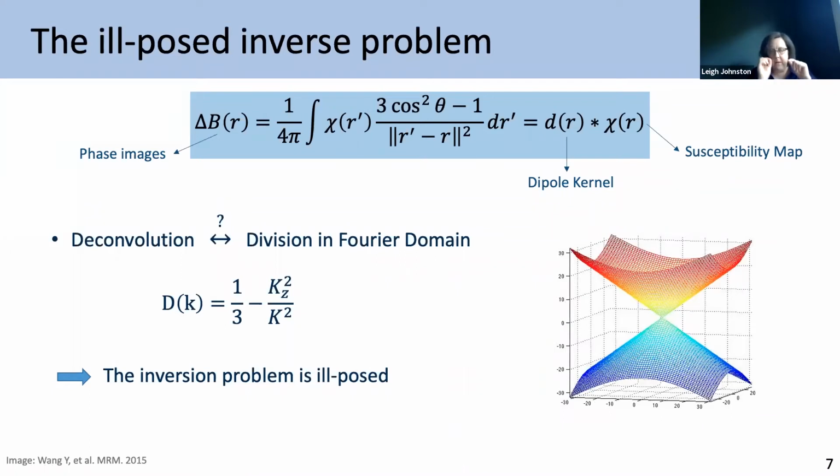However, there is a problem with this, and it's this equation on the left-hand side, if you're interested, where there's this three-dimensional K space, or Fourier spatial frequency space. When this value is equal to 0, then we have an unsolvable problem, essentially. So our inversion becomes ill-conditioned, and this causes problems and artifacts for us when we're trying to get at this chi value. And so all of these QSM methods that have been in the literature for so long, the reason that there isn't just one way to do this is because everybody's trying to work out how to remove the artifact the best.